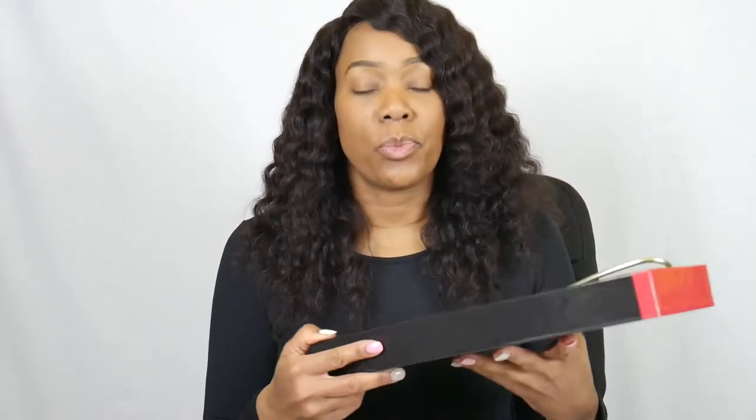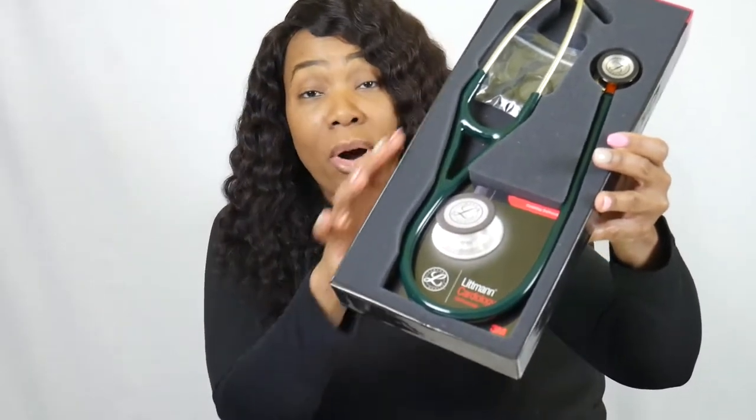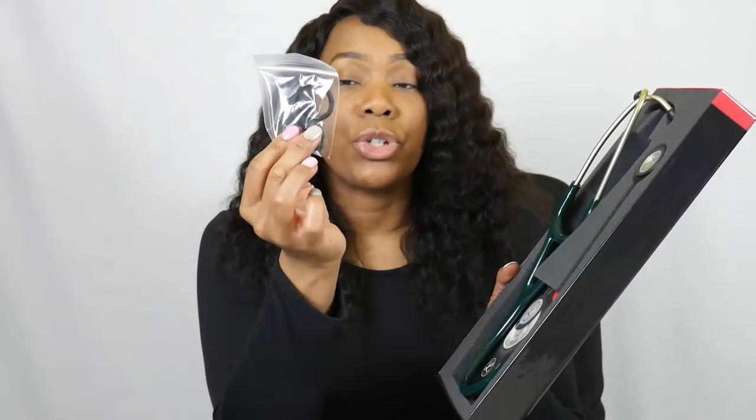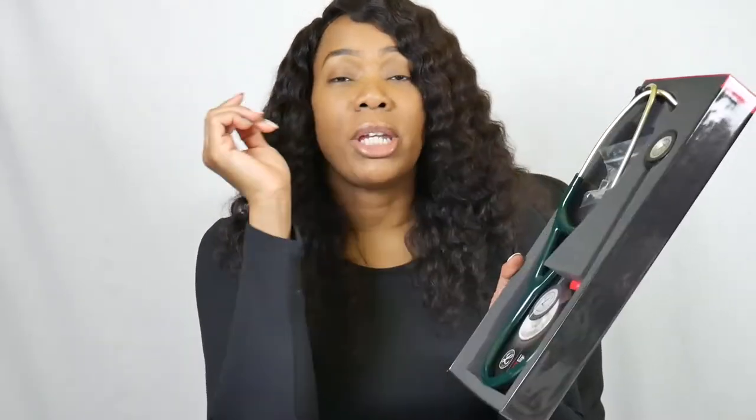This is what the Cardiology 4 looks like in the box. It has a manual — I don't know why they put a manual in there, but that's nice. This is the kit it comes with: two ear tip replacements, the bell, and a pediatric side piece, because the pediatric side can be used as an open bell.